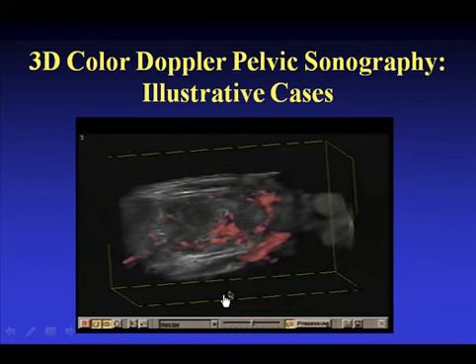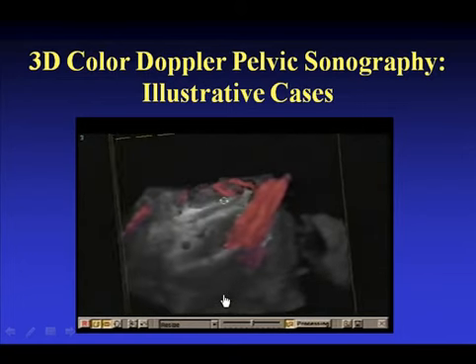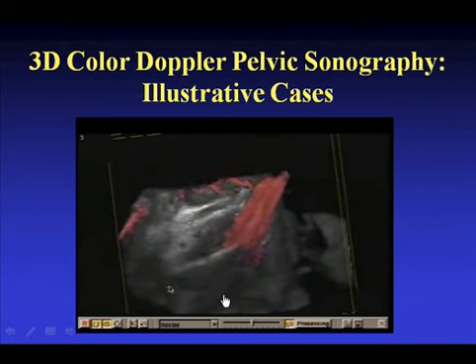So it's very helpful in identifying the proper route for placement of needles and aspiration. Here we're putting back the tissue that we removed.